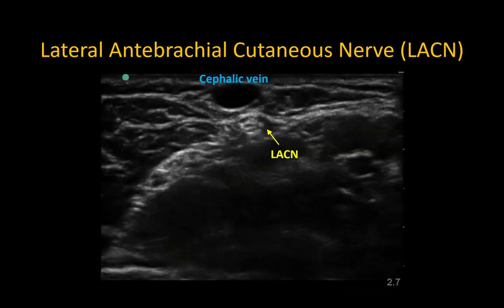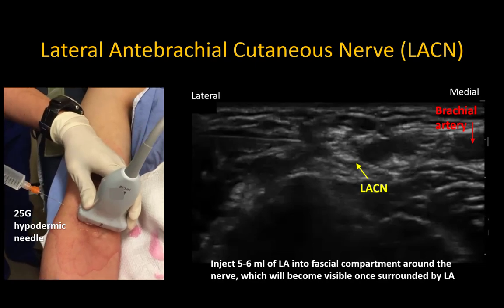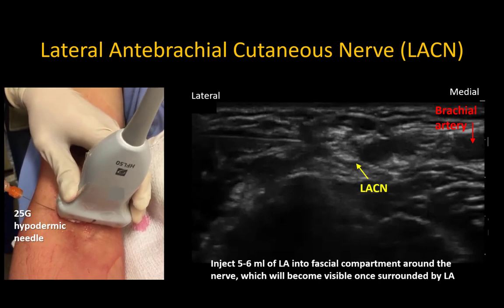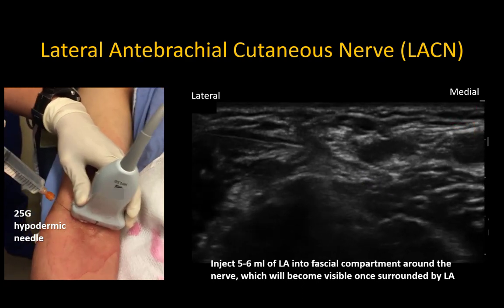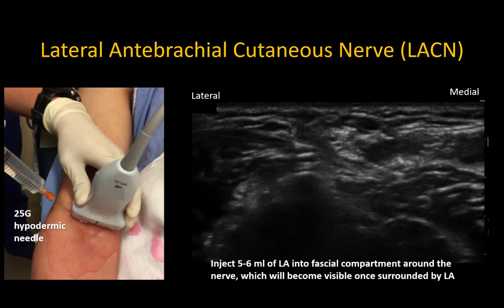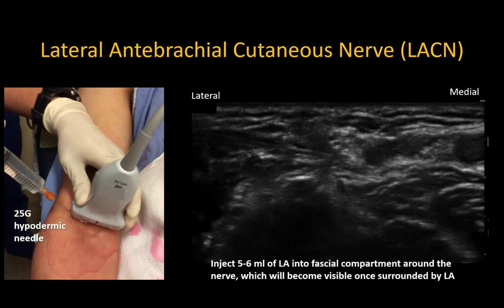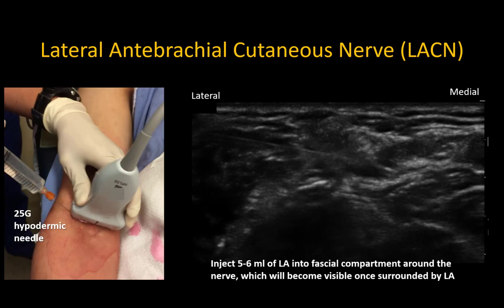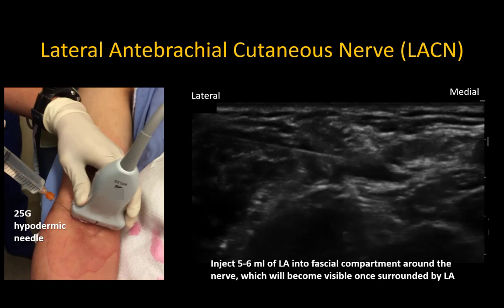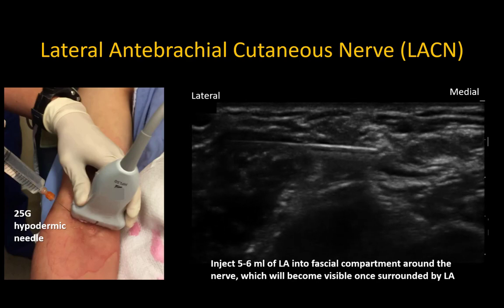Occasionally the nerve will be large and visible, as in this example; however, if it's not clearly seen, just target the fascial condensation adjacent to the vein. A 25 gauge sharp hypodermic needle is preferred for subcutaneous injections as it penetrates skin and fascia with less effort and allows better control of needle advancement. Inject slowly and continuously while advancing into the fascial compartment; this creates a fluid jet that pushes the nerve away from the needle tip, and the nerve often becomes visible as local anesthetic surrounds it. Inject five to six milliliters of local anesthetic within the fascial compartment to effectively block the lateral antebrachial cutaneous nerve.